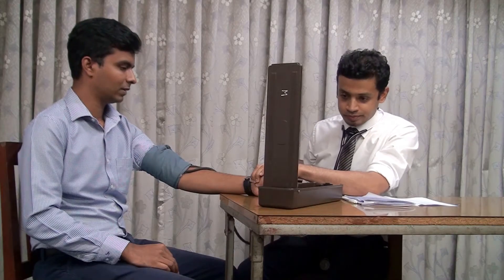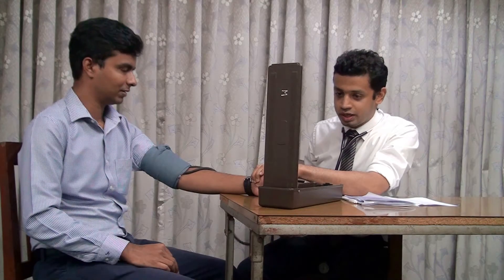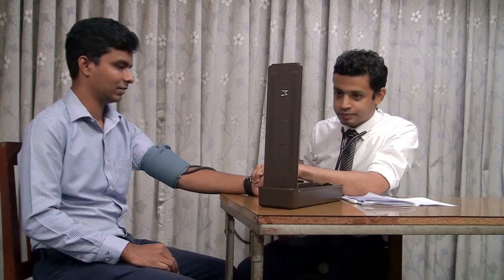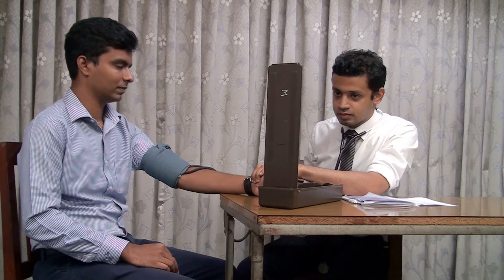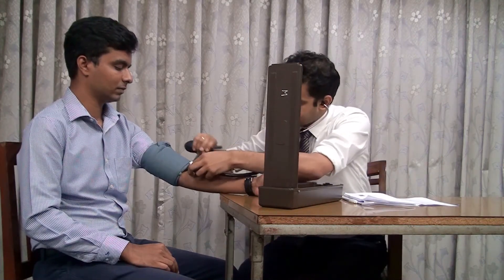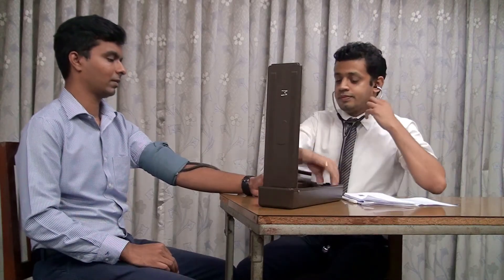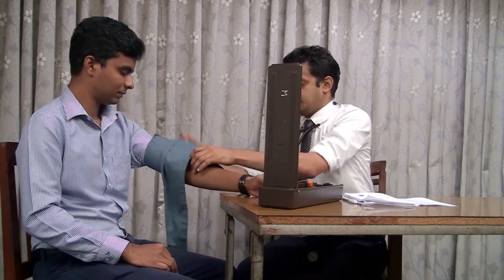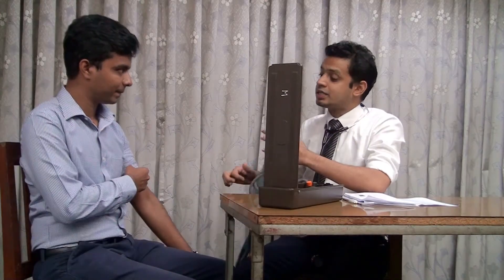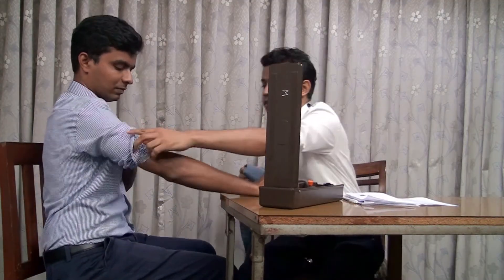We put the cuff on the bottom. I'm gonna put the cuff in this place. I just put the cuff in the middle. Now we have to make a small amount of pressure.